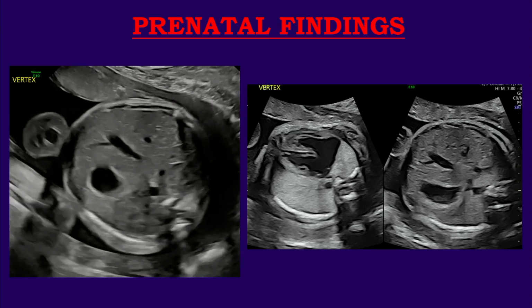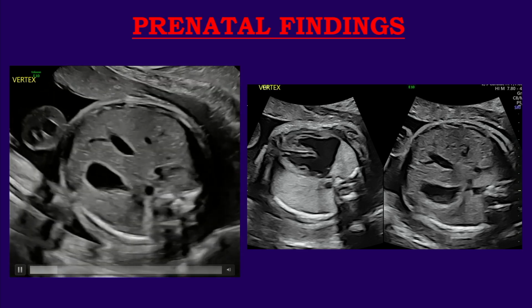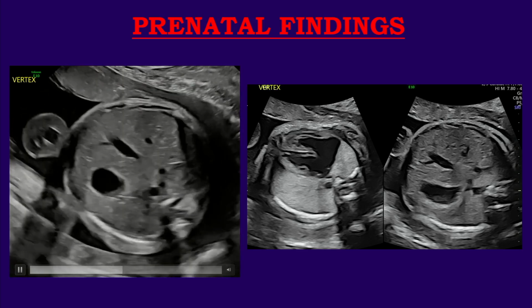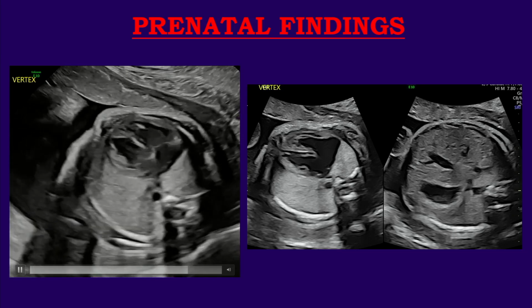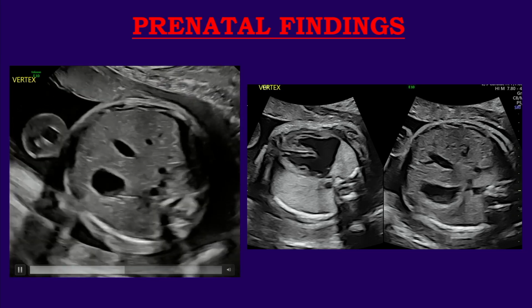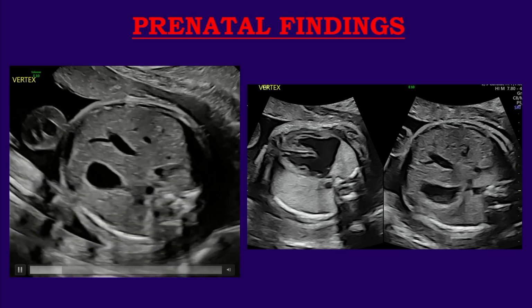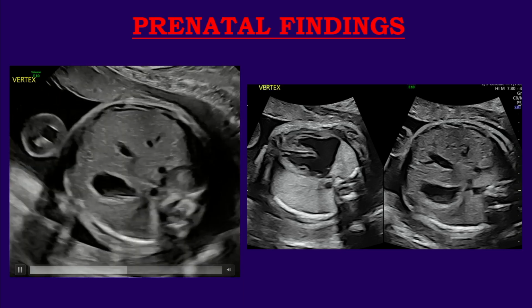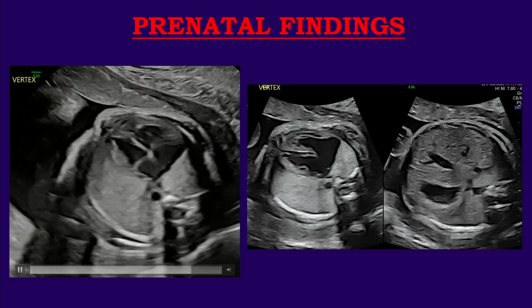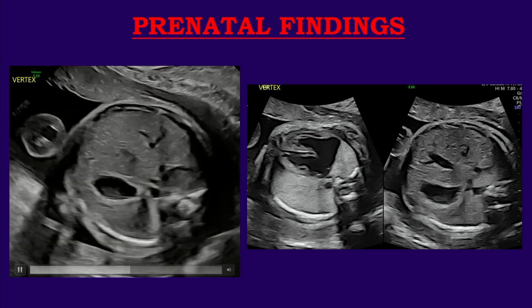So the situs, here we have the baby in the cephalic position. We can see the heart, if it's cephalic, completely in the right chest. So this is significant dextroposition. So then we think about dextroposition. This is something that usually is induced from outside. So it's either diaphragmatic hernia or some primary lung disease, such as the CPAM or the bronchopulmonary sequestration.